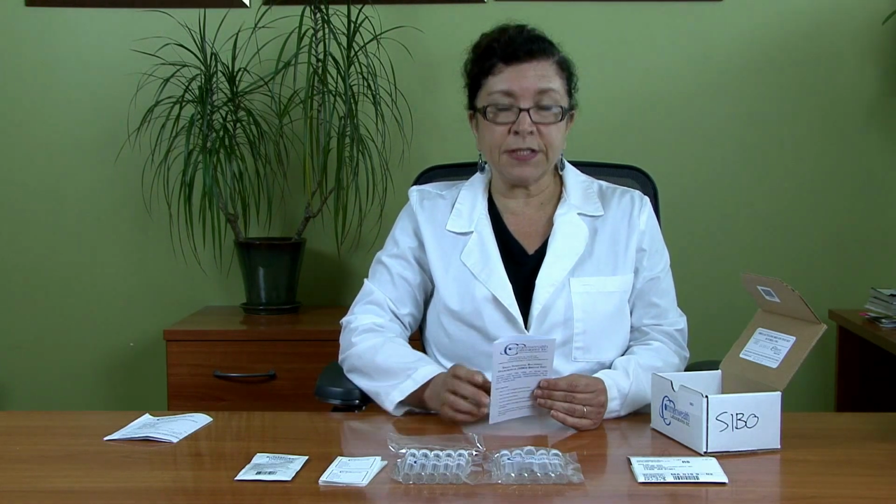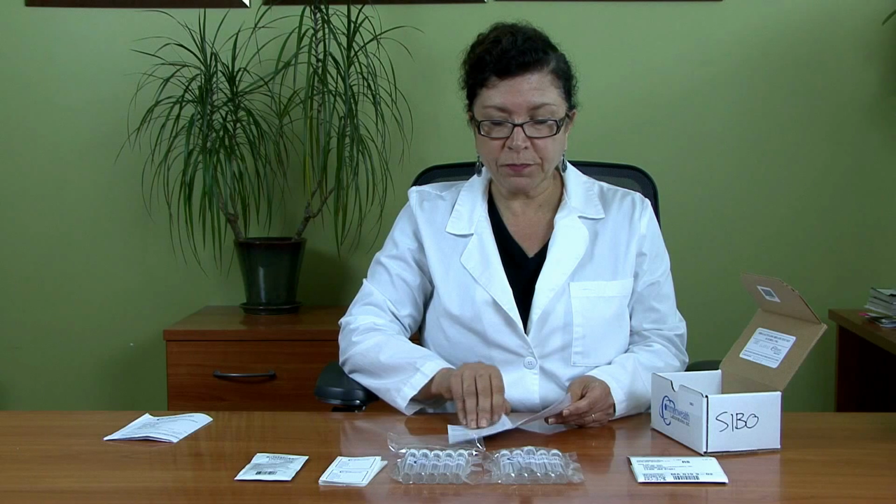Now it's very, very important that you read through this and understand what the restrictions are. Along with restrictions, there's a very specific diet that you have to eat at least 24 hours prior to the test. And then on the day of test, of course, it has to be absolutely fasting specimens. So let's talk about those restrictions.